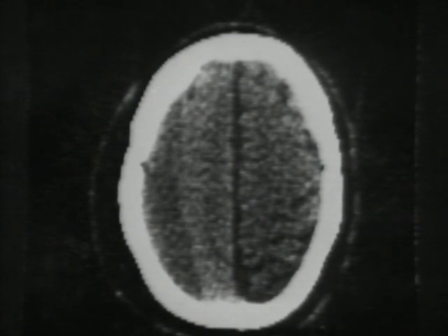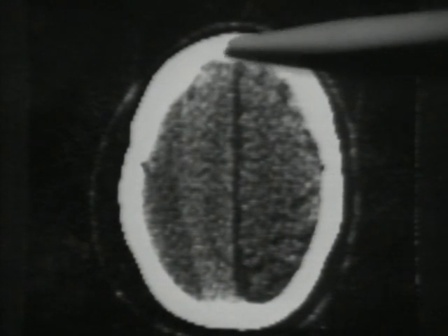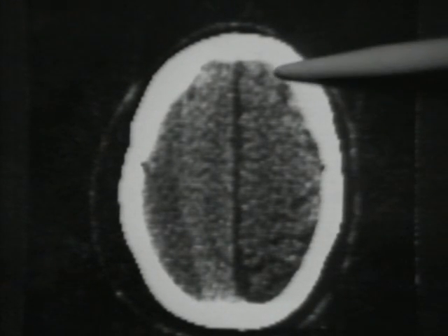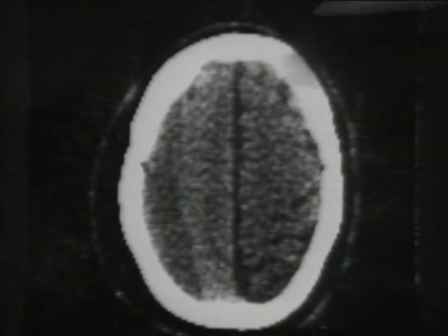The large displacement of the ventricular system and the unbroken, apparently normal brain density should point to the correct diagnosis. Now, here we have a typical low-density subdural hematoma. You can see the low-density crescent capping the cortex on the left side. But there is more detail in this. If we look at the contralateral hemisphere, we can see the cerebrospinal fluid lying along the falx cerebri on the right side, and we can also see some detail of the cerebral sulci, but none on the left side. This is an indication that the subarachnoid space on this side and the cerebral sulci are compressed.